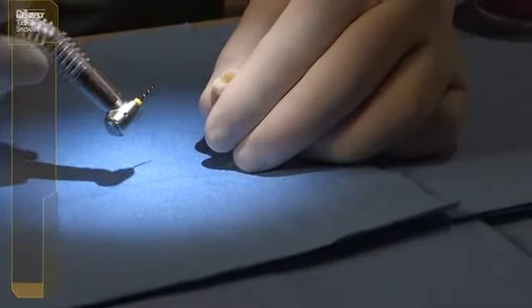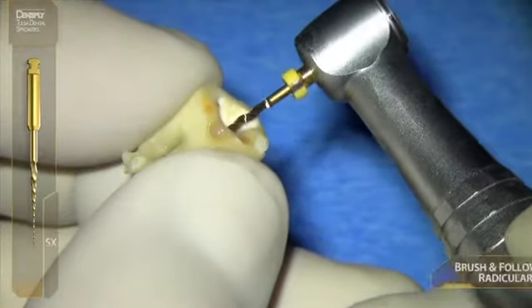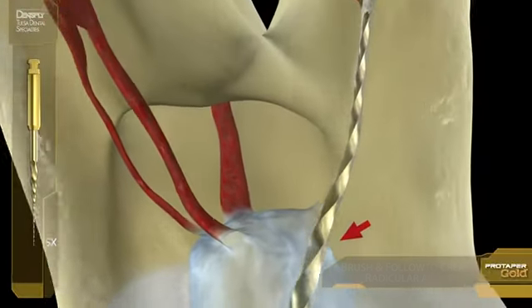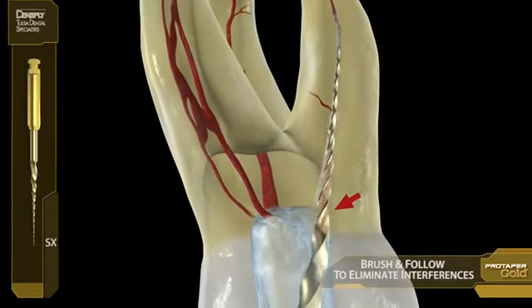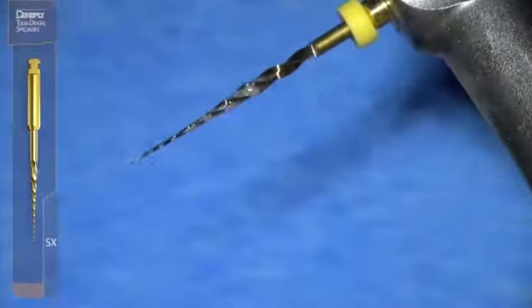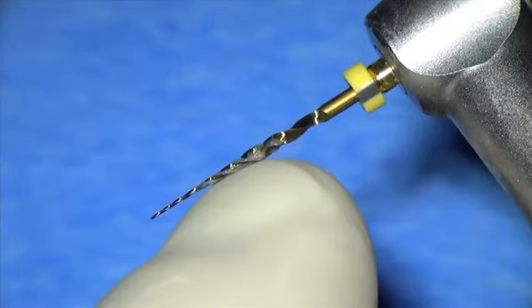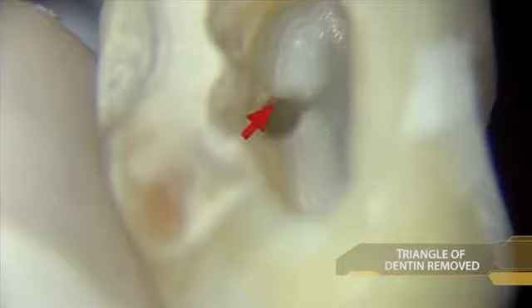So back to our patient. We want to remove that triangle so that we have unfettered access into the distal buccal and we can float, follow, and brush our way there with the SX. So we brush and follow, brush and follow, and brush and follow. So we simply paint away that dentinal triangle. And you can see the dentin that we've removed from that triangle in the blades of the SX. So instead of now the dentinal triangle, we have a tunnel that we can easily follow.